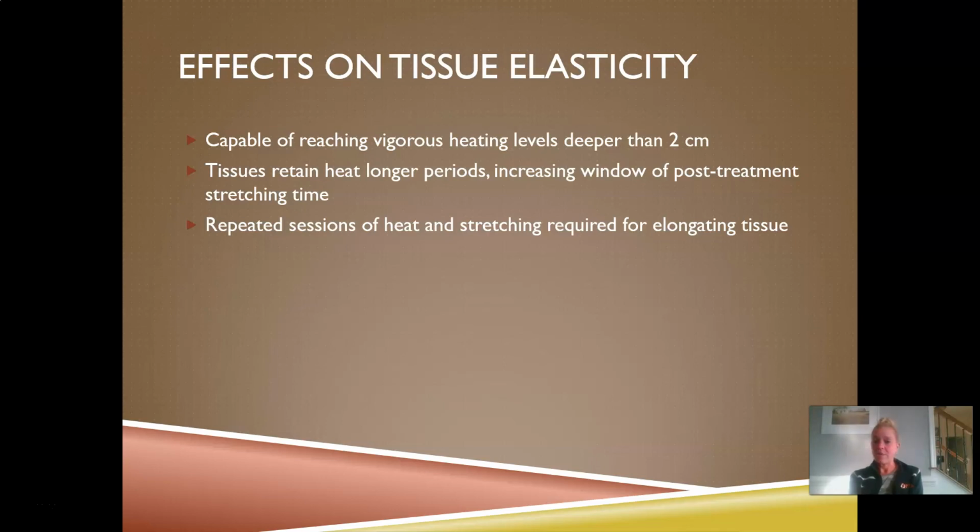So we talked about those post-treatment stretching time windows with ultrasound. It was a couple of minutes, again, depending on frequency a little bit. With diathermy, because we're heating a larger area, you probably have a little bit longer to stretch the tissue afterwards. And again, we're always going to need repeated sessions of heat and stretching to actually improve range of motion.